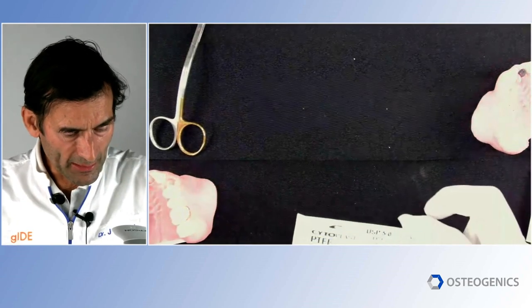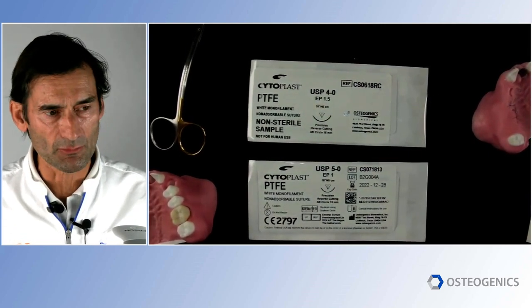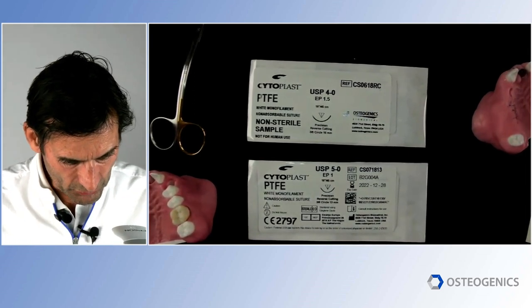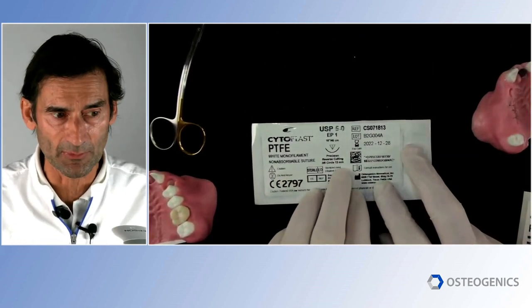Then you do have, of course, the opportunity to switch it around a little bit. And you can see a 4-0 and a 5-0, and definitely very useful as well. And you just kind of have to see when is your indication to do this. They both work. Of course, the beauty with the 5-0 is that it gets thinner, and you can also see the needle is a 13 millimeter.